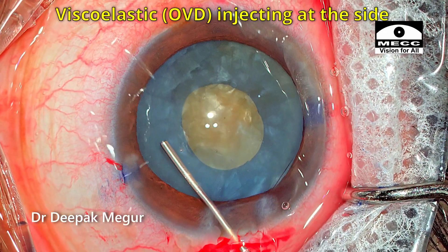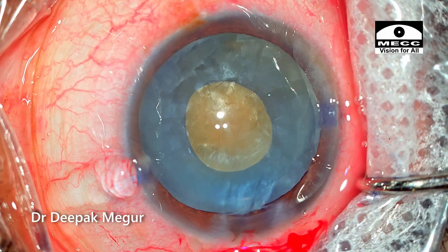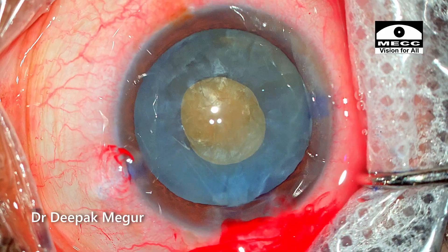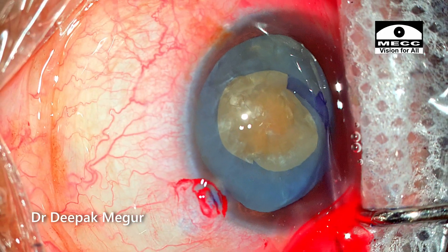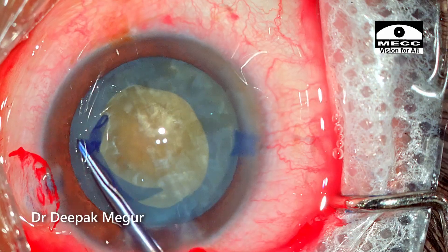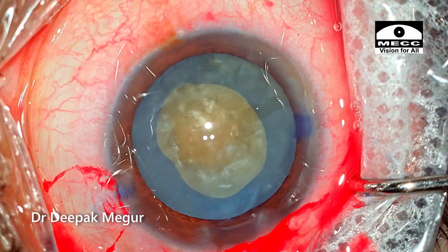Viscoelastic injection is done at the side, not in the center, to ensure that the viscoelastic does not go into the bag. A tangential cut is given using micro scissors, and then with Dr. Haldipukar forceps, the rhexis is again enlarged to the desired size.